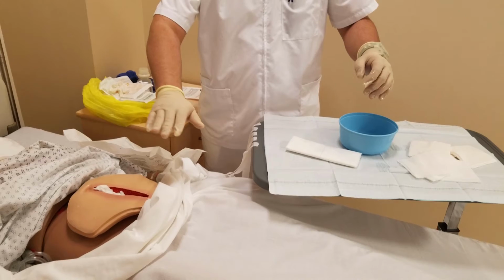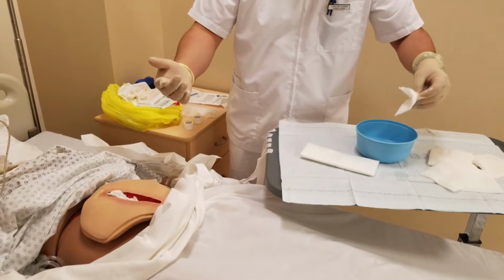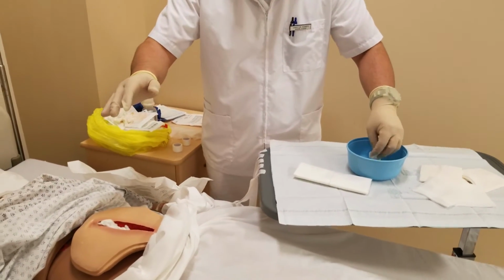So when we're packing, you want to make sure that it becomes level with the rest of the body. So it's level with the upper border of the wound.